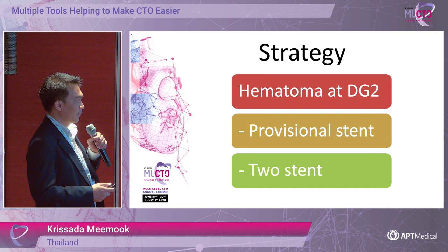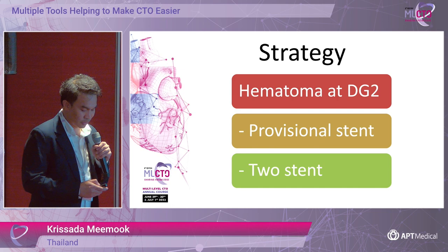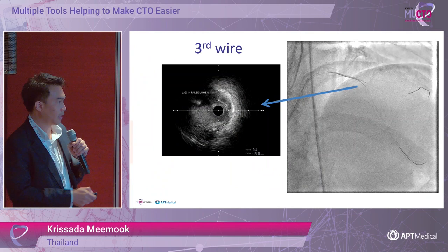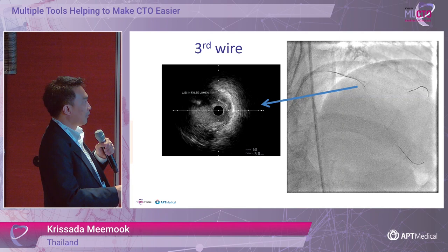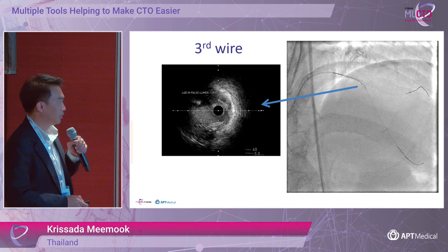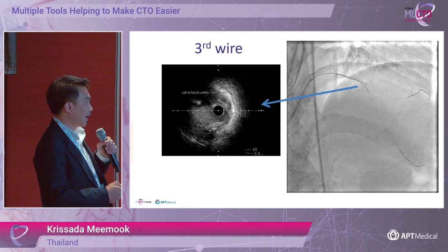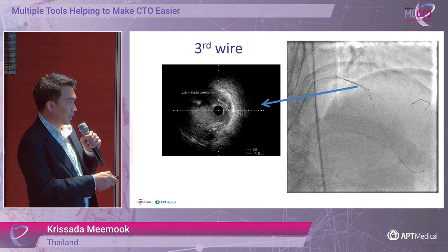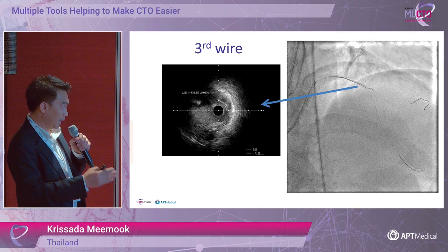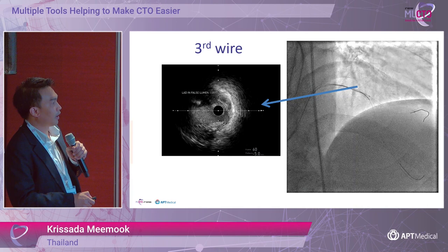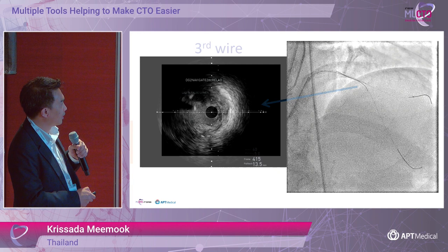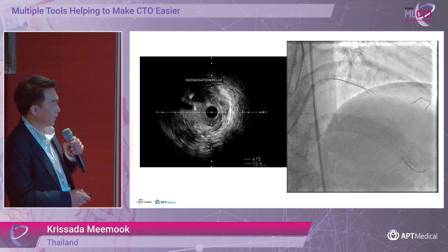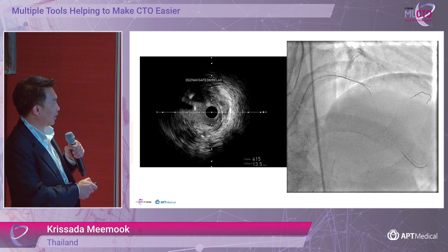The question now was: should we do a one-stent provisional or a two-stent approach? But first, we had to reposition the LAD wire because it was in a very long subintimal space. So we used real-time IVUS guidance. With IVUS in diagonal 2, we could see the LAD wire was in the false lumen. We put a third wire — the Pilot 50 — and tried to navigate to the septal side of the LAD, because we saw the existing wire was on the lateral side and the true lumen would be on the septal side.